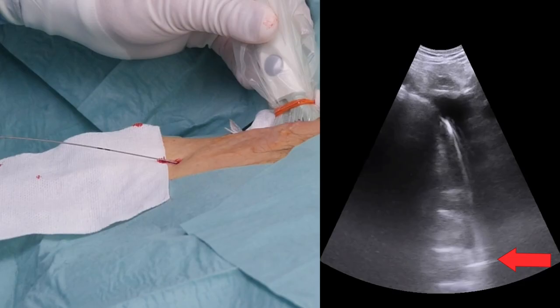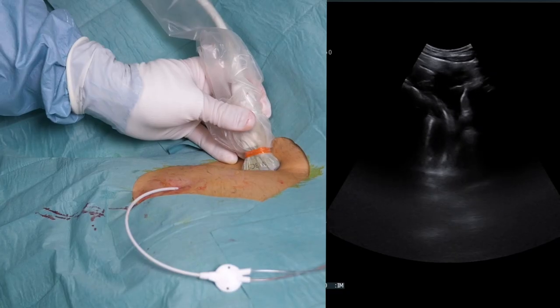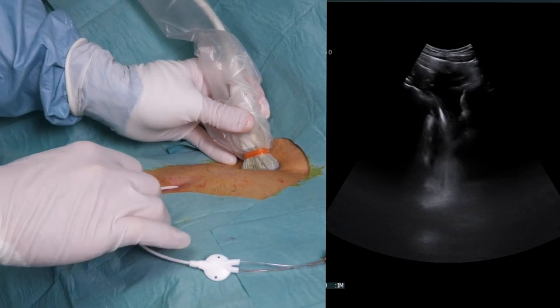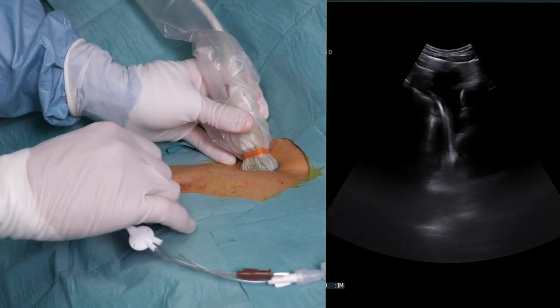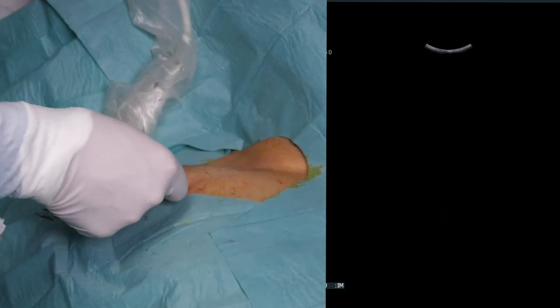Many commercial CVC kits come with guide wires that are too short — meaning that when the J-tip reaches the RPA, the amount of guide wire left outside the patient is shorter than the central line, effectively forcing you to retract the wire when you thread the catheter. In these cases, use the supraclavicular fossa view to make sure that the guide wire and the threaded catheter head in the right direction towards the superior vena cava during insertion.